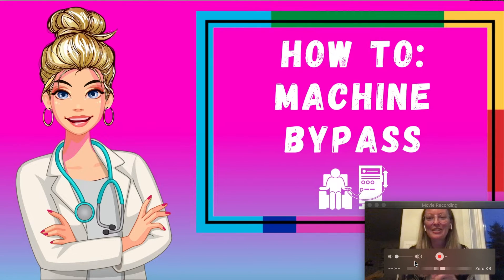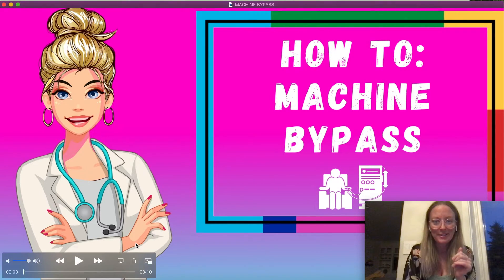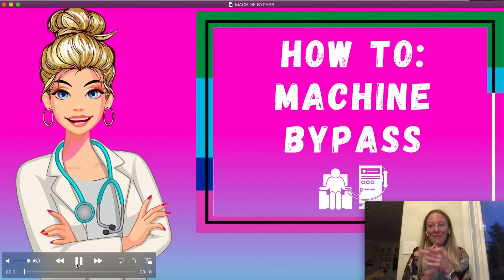Lindsay here. I'm so excited to show you how to put a machine in bypass, and I was given the wonderful opportunity to do it in real life. I will start the video and I'll be hanging out in the corner there and I will narrate everything.